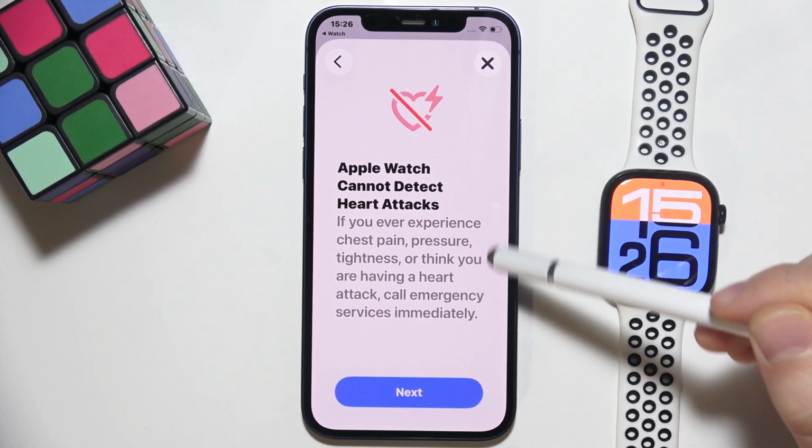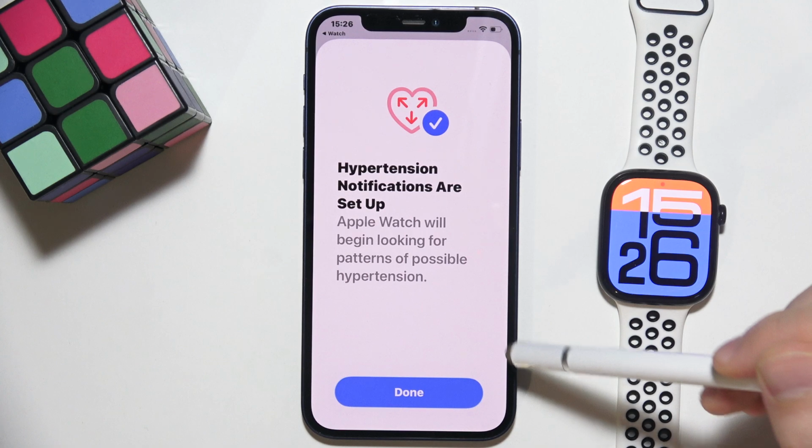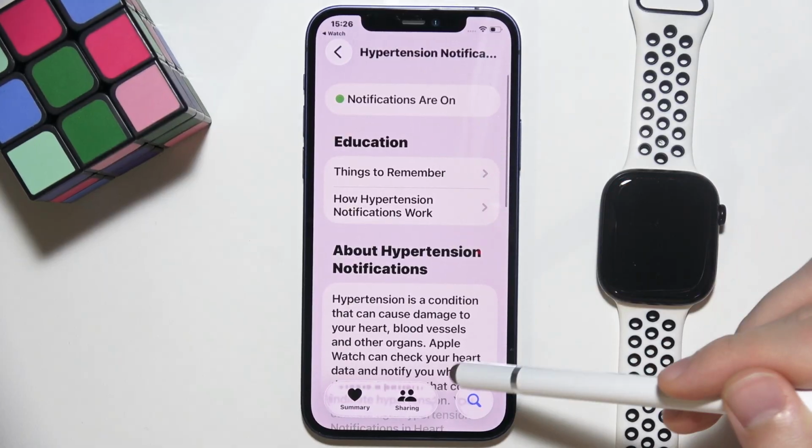Click next. Apple Watch cannot detect heart attacks. Click next again. Hypertension notifications are set up. We have to click done, and now as you can see, it's available.